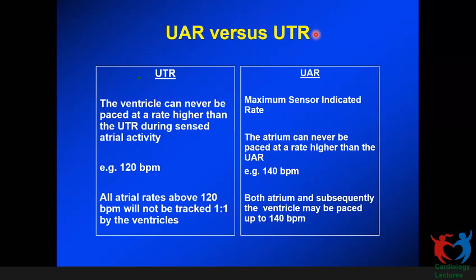And so Vatsal again is asking, when programming blanking periods, what are the usual values and guiding principles? So blanking periods, most are sort of fixed, only some are programmable. Most of the time, unless there are specific issues, we leave it at nominal settings. Govind, do you want to say anything about the blanking period issues? Very rarely do we have to program around that or change it. Yes, agreed. It's extremely rare that we touch a blanking period.